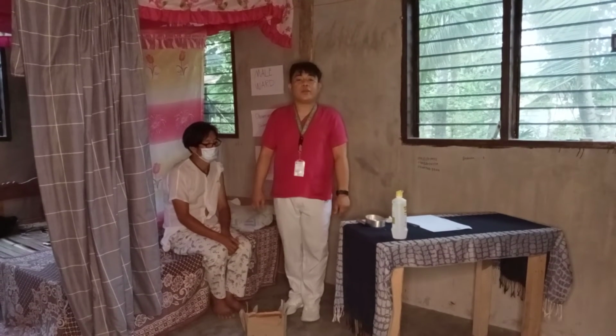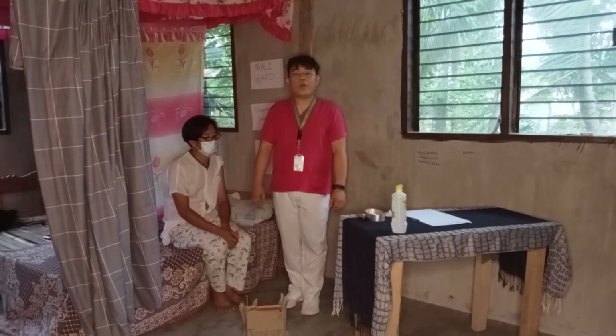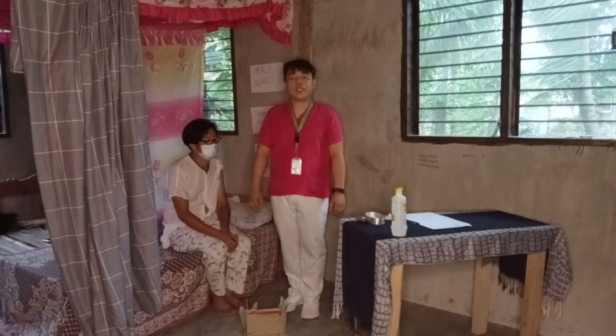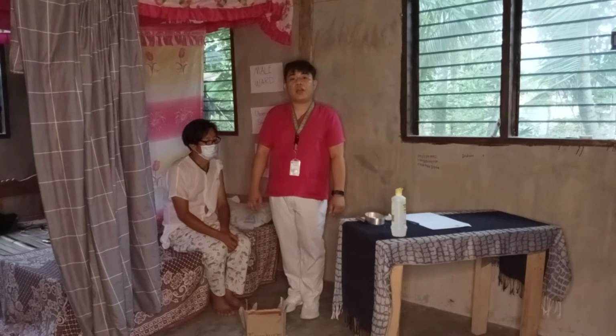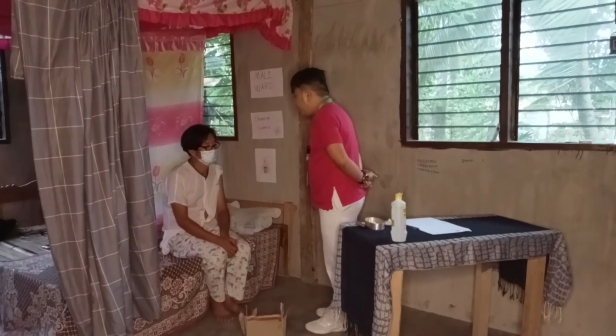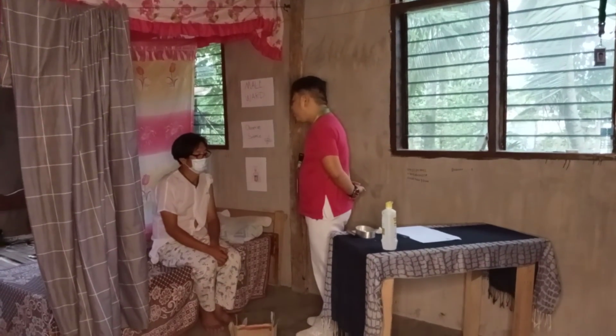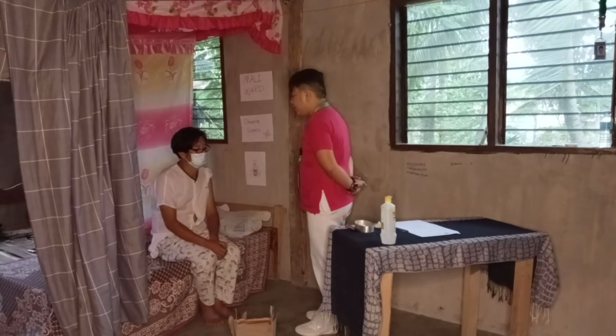Inform the client of the thermometer reading. Rationale: to promote participation in care and understanding of the status. Sir, 37.5 po ang inyong body temperature. Normal po yun. Wala po kayong lagnat.